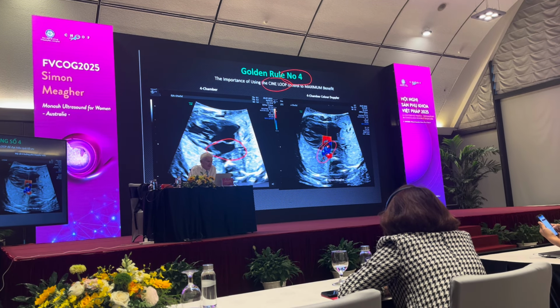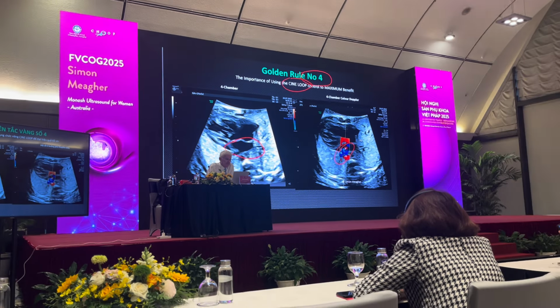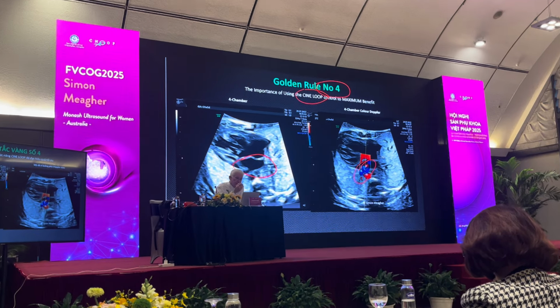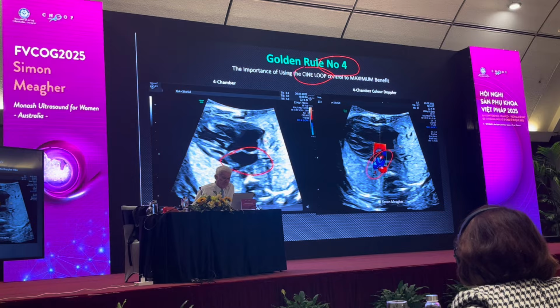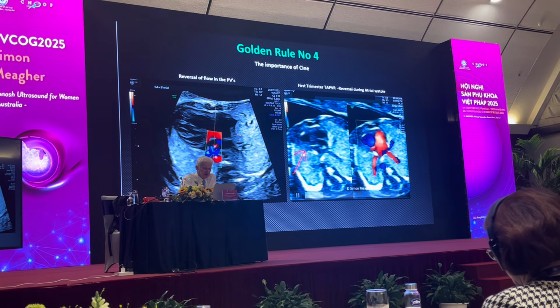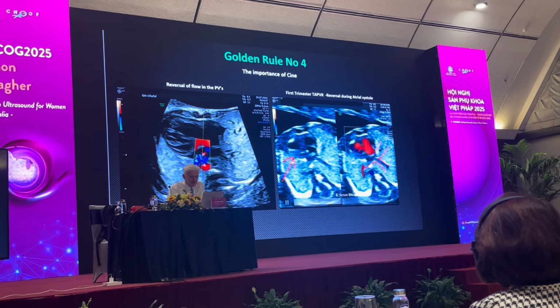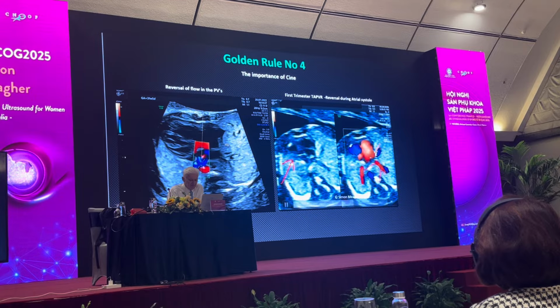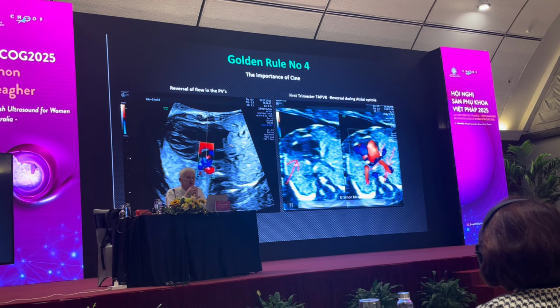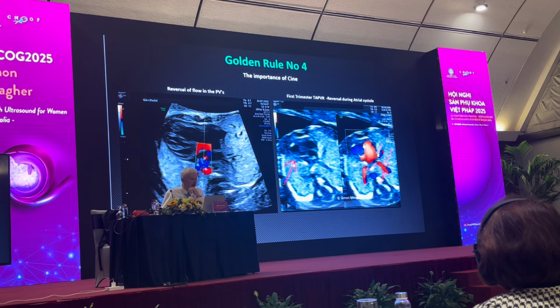A baby with a hypoplastic left heart with reversible flow in the pulmonary veins is going to crash after birth. But if I look at the cine loop in slow motion, then I appreciate that what I've seen is real. This is a baby with a hypoplastic left heart at 13 weeks of gestation that I showed you yesterday. It's only when you turn it down very slow, you see red, blue, red, blue with each contraction of the heart. So you get reversals of flow at 13 weeks of gestation in the pulmonary veins with the hypoplastic left heart.